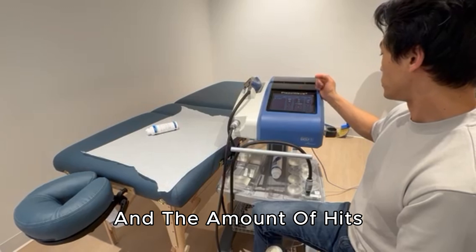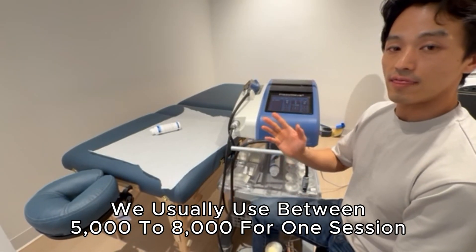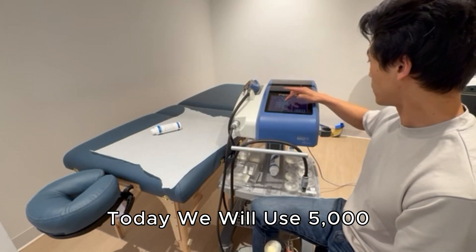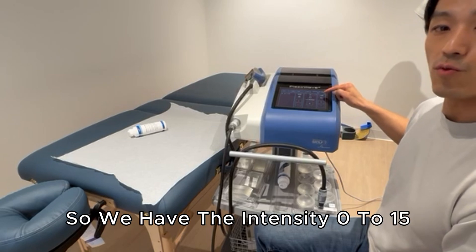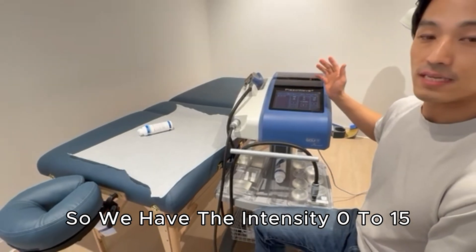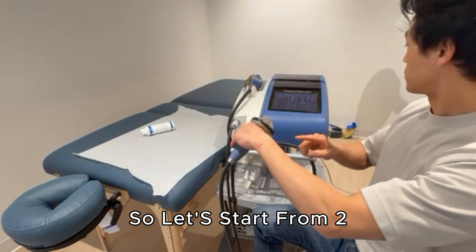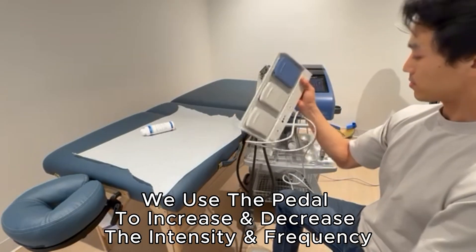The shot count — we usually use between 5,000 to 8,000 for one session, but right now I'm going to use 5,000. Then there's intensity, which goes from 0 to 15. This area is very sensitive, so I'm going to start from intensity 2. You can decrease the frequency and intensity with the pedal.